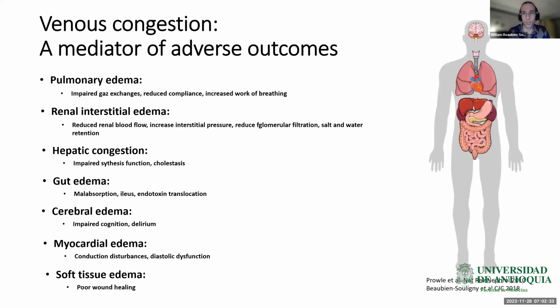All right. So as you see, the pattern of venous return will change. And secondly, because the venous circulation becomes non-compliant, these variations in right atrial pressure will be transmitted further in the venous system, and we'll see the development of pulsatility in these peripheral veins.